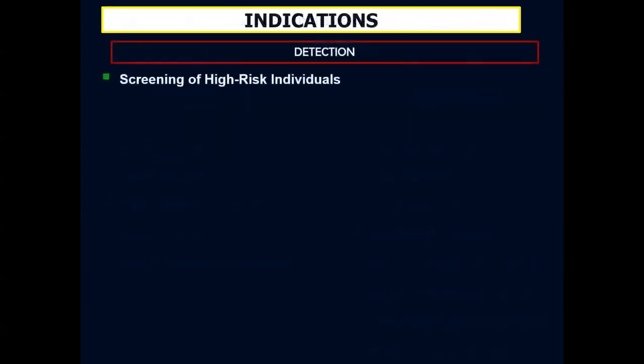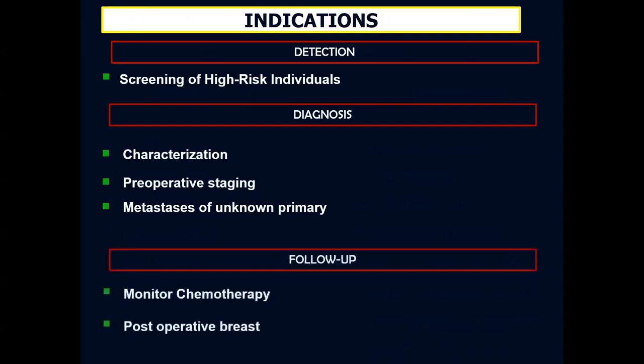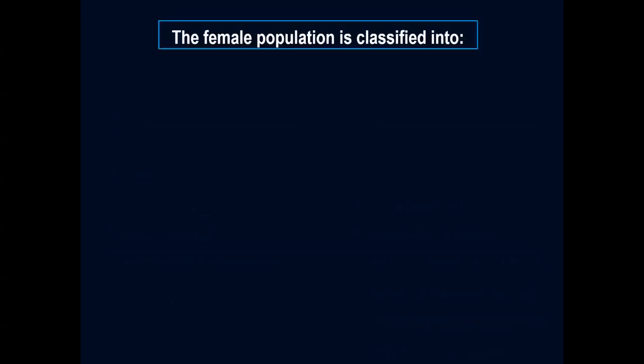They are both indicated in detection, or what we call screening, and when lesions are identified, they are indicated to characterize these lesions and to preoperatively stage them, and they are also indicated in the follow-up of treated breast lesions. We'll start by having a look at detection.